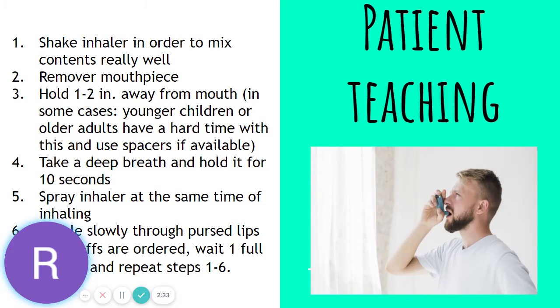A little bit about patient teaching. Make sure to shake the inhaler in order to mix the contents really well. Remove the mouthpiece. Hold it 1 to 2 inches away from the mouth. In some cases, younger children or even older adults have a hard time with this, so spacers are available.